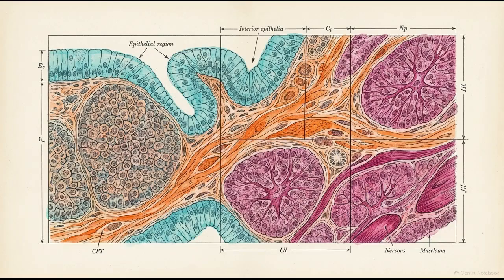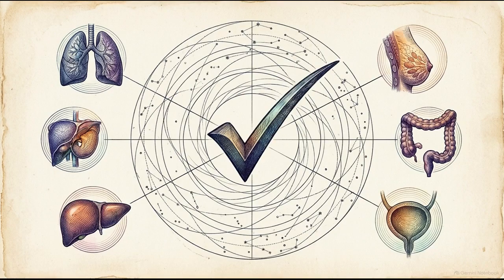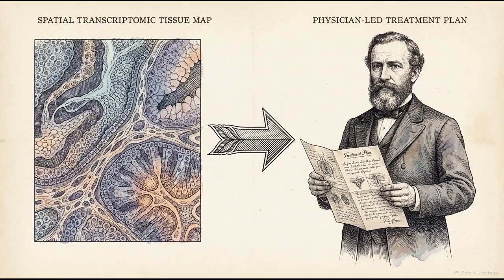The model analyzed over 25,000 structures, cross-referencing genomic data to learn subtle morphological shapes visible on routine pathology slides. The resulting AI can automatically segment a standard tissue slide and color-code the specific early, primary, and secondary maturation regions. The model achieved high diagnostic accuracy and successfully generalized to cancer types that were not included in its initial training data. This pipeline connects high-dimensional biological discovery to scalable clinical application.